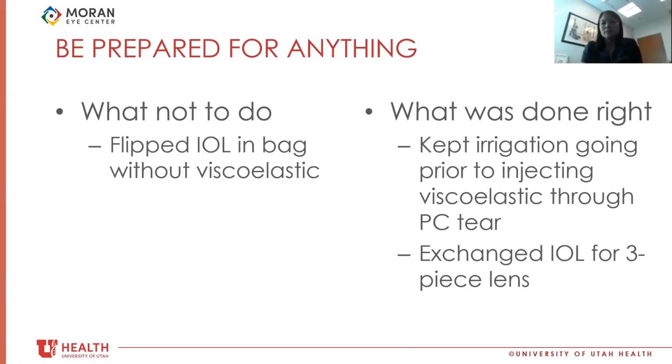But Amy, what's really interesting there is that I think the key, as you have already mentioned, is you didn't yank out that irrigating cannula, right? You put the viscoelastic in, and made sure that the eye was pressurized before doing so.